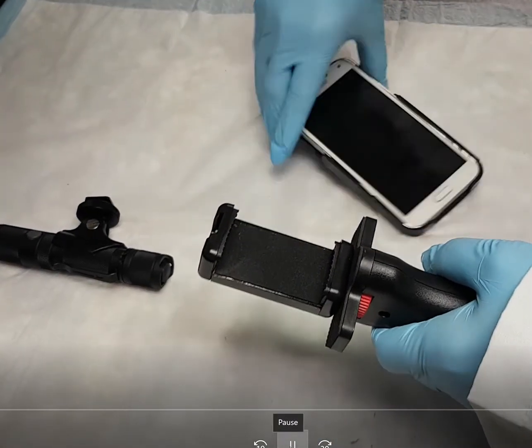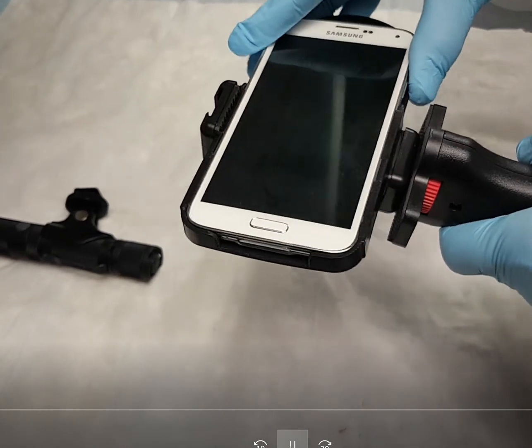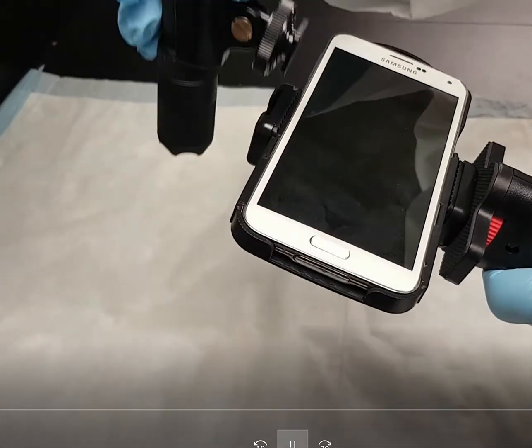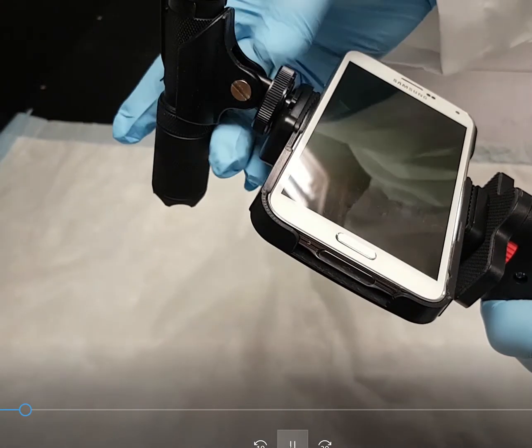Assembling the Forensic Cam is simple and fast. The smartphone holder adjusts to fit your smartphone. You supply the smartphone, or we can supply a refurbished smartphone to reduce the cost, to use as a viewing and imaging system only.